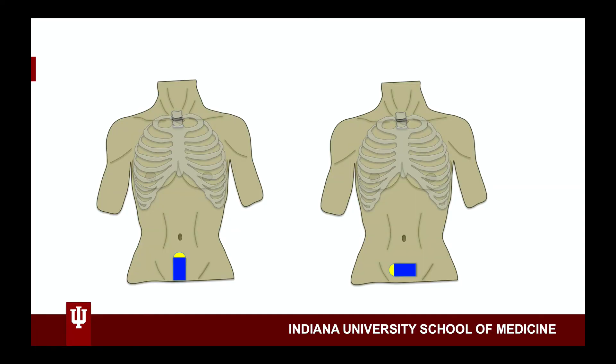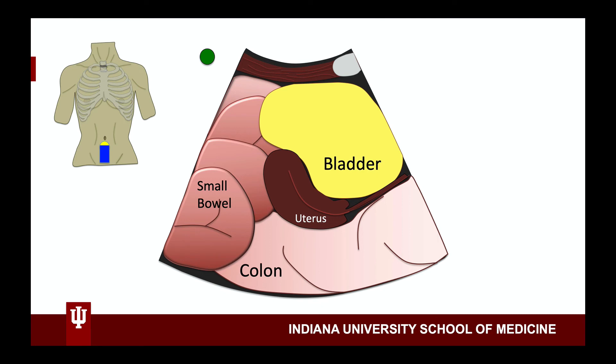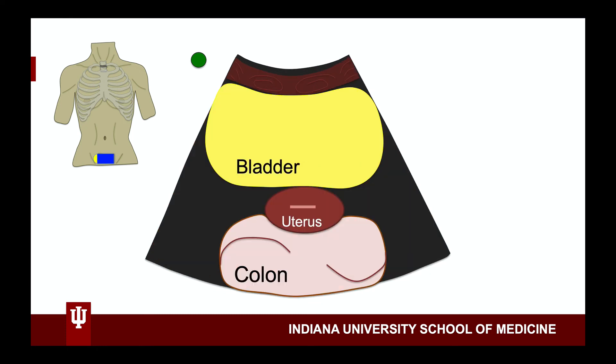To perform the bladder exam, we will find a measure of the bladder in the sagittal and transversal orientations. In the sagittal view, with the probe placed just above the pubic symphysis and the marker dot pointed towards the patient's head, you will drag the probe back and forth. Rotate the probe counterclockwise so that the marker dot is pointed towards the patient's right.